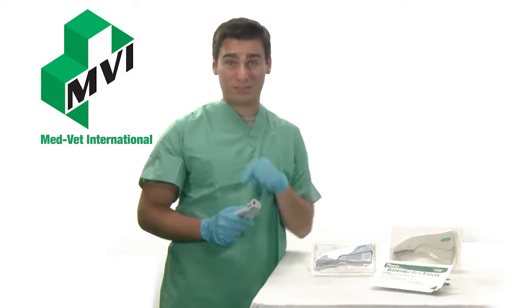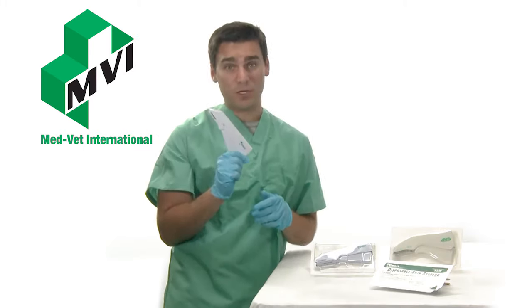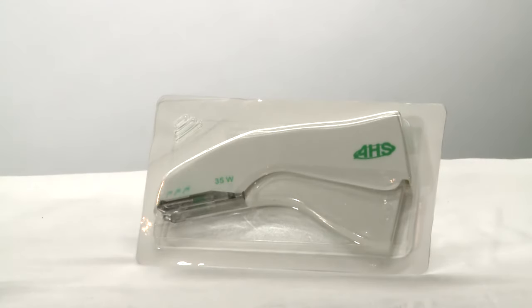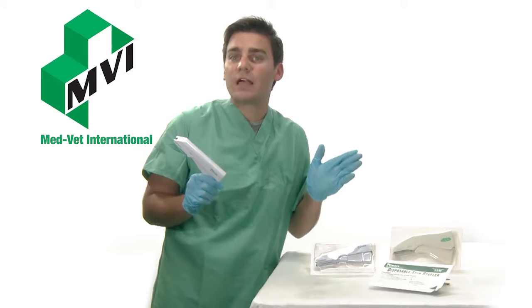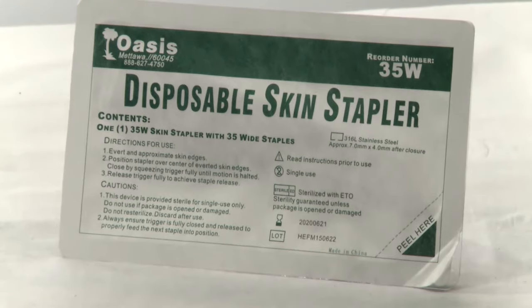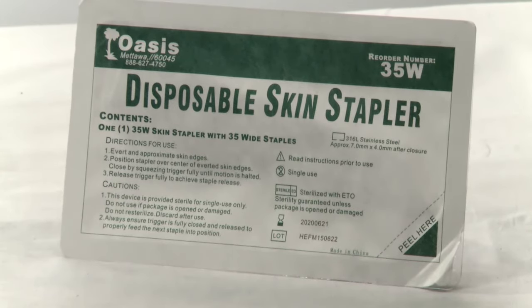The AHS Premium stapler is similar to the 35W, but has a new ergonomic design which features an angled head for better visibility. All staplers have 35 preloaded, sterile, surgical, stainless steel staples, and each stapler is designed as one-time use only.